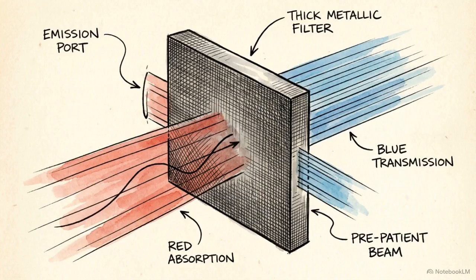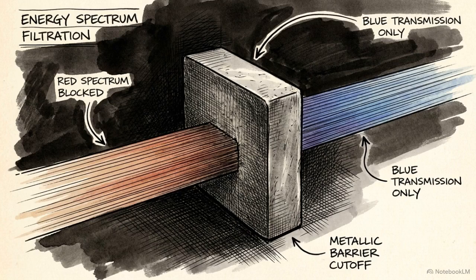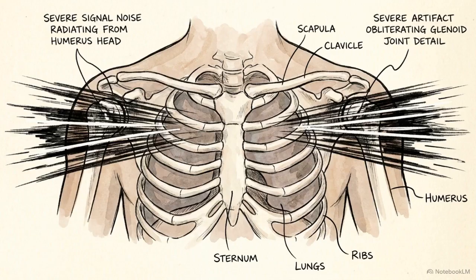Pre-patient filters can correct this by absorbing soft X-rays before they enter the patient. Additionally, bow tie filters pre-harden the beam at its edges to better match the patient's physical profile. Beam hardening reveals that X-ray attenuation involves a continuous shift in the beam's energy profile that must be physically filtered for accurate reconstruction. Other errors present as prominent streaks, usually seen projecting across the shoulders or hips.